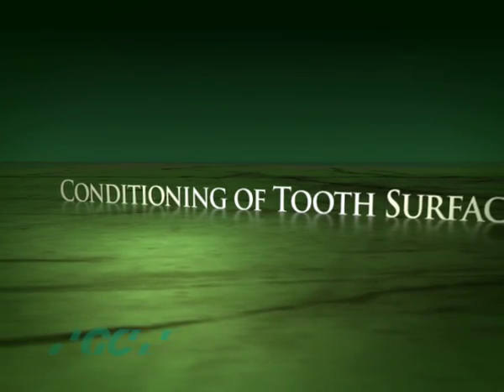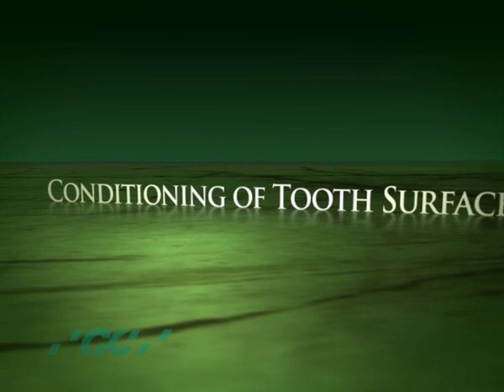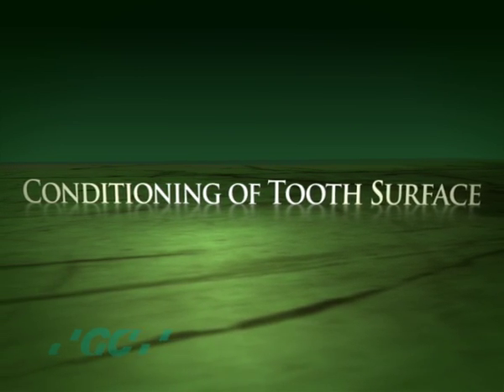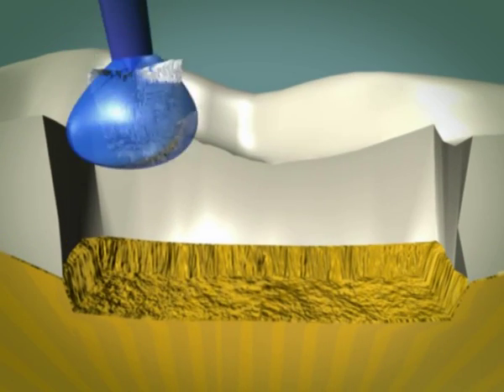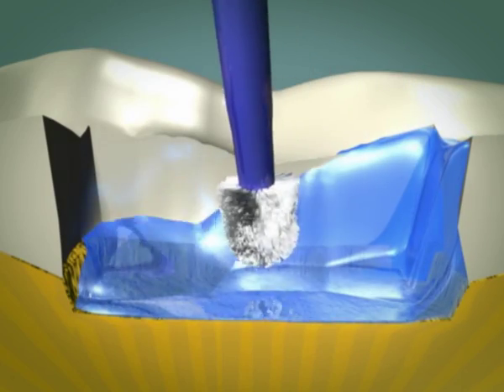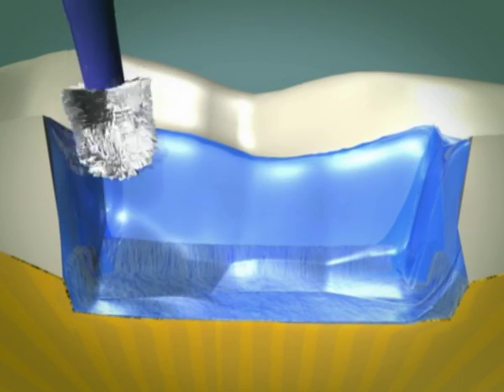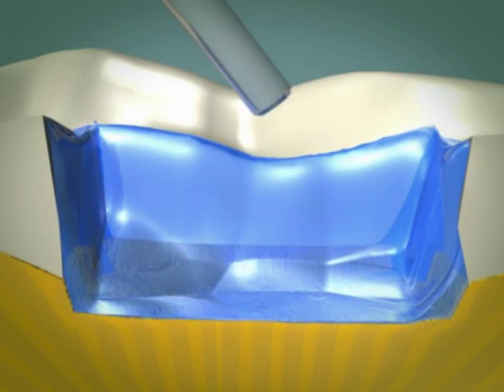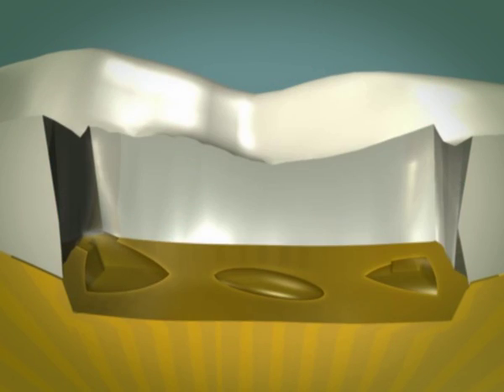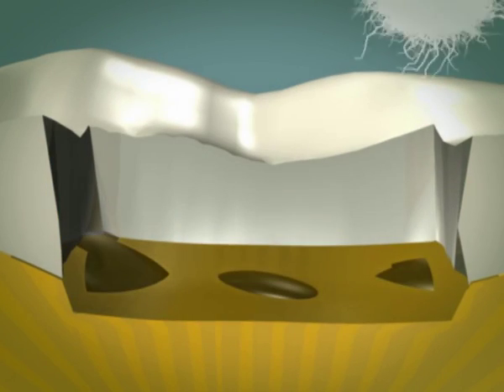Glass ionomer-based materials are exceptionally good adhesives. Prior to placement of a glass ionomer, it is beneficial to prepare the cavity surface by applying a polyacrylic acid conditioner. After 10 seconds, the conditioner is washed off, removing the smear layer and surface debris. Excess water is then removed without over-drying the surface.